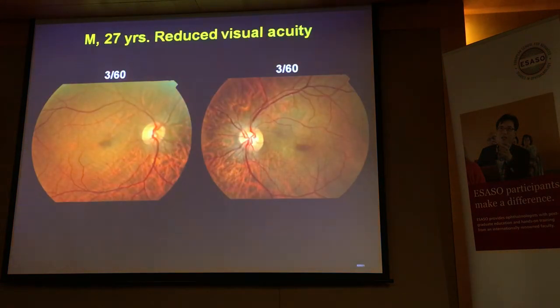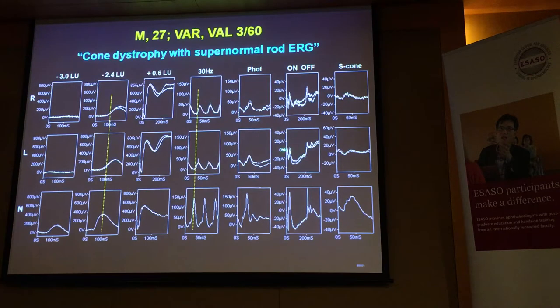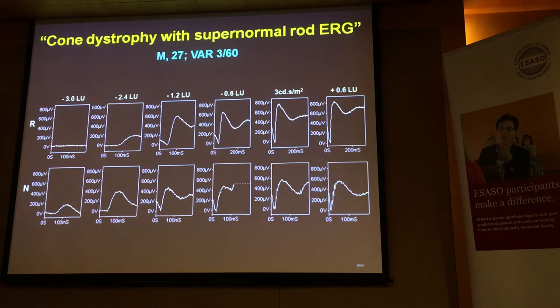If we look more specifically, this is a patient with the disease and central atrophy. Delayed flicker ERG, that's the cone dystrophy part. Massively delayed rod-specific ERG, nothing but a dim flash. Characteristic change here. And if you look now, the way it builds up, you can see it's completely different. So the reasonably uniform increase that you expect in normal, here you go from nothing to unusually delayed to shooting up to 600 microvolts. And there you see the classic shape only with the bright flash. A-wave comes down, sits a bit, drops, and shoots upwards.